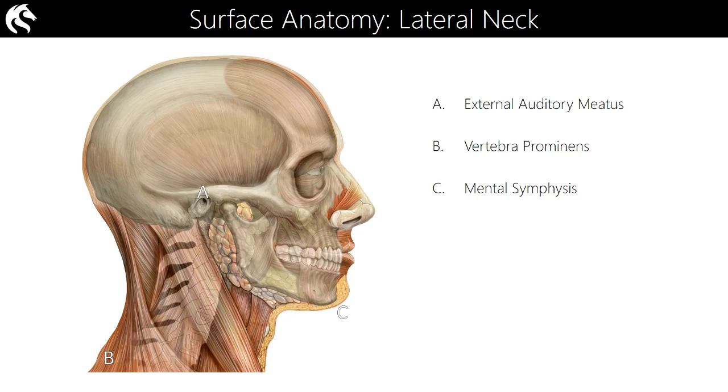Now, one of the projections which I'm going to be talking about today is the lateral airways projection. The lateral airways projection is very similar to a lateral cervical spine projection. However, it does vary because the purpose of a lateral airways projection is not just to show the bones and muscular structures, but also to show the airway-filled structures. So in the past, you have had the mindset that if you've included the ear hole, you've gone up far enough on a cervical spine. When we do airways, we're going to include a little touch more because we never quite know when some little kid has decided to put a bead or a button right up their nose. So we need to include a little touch more.